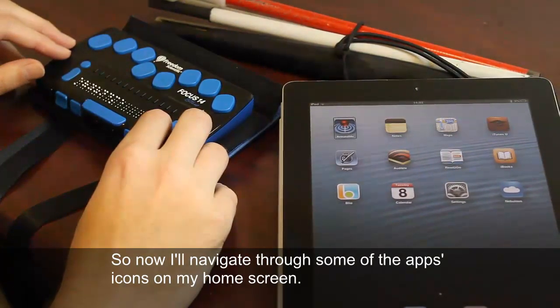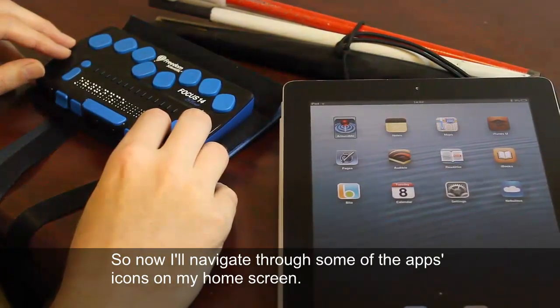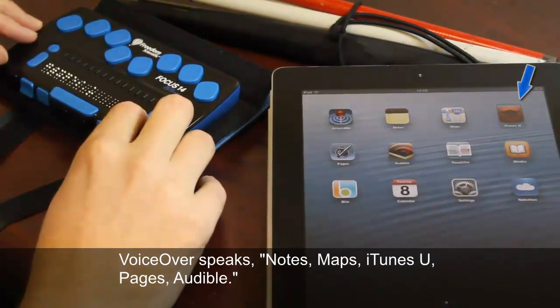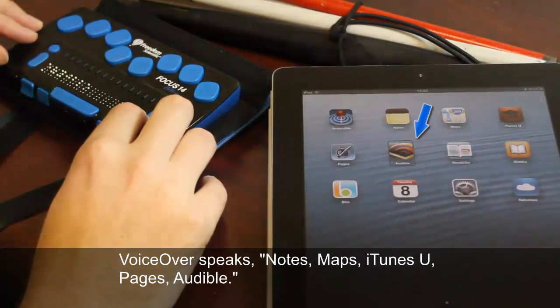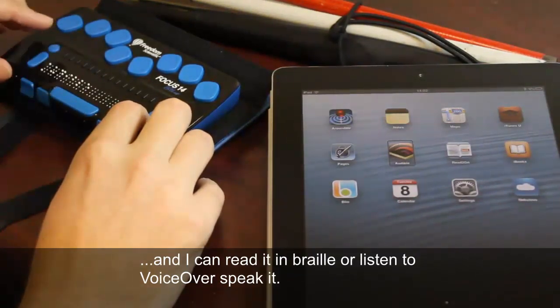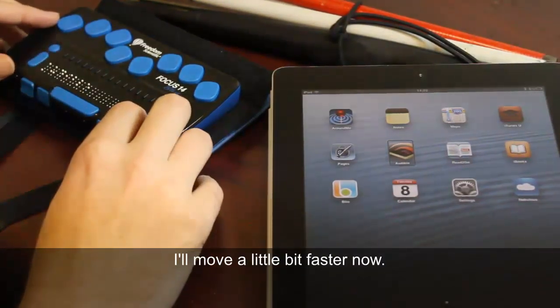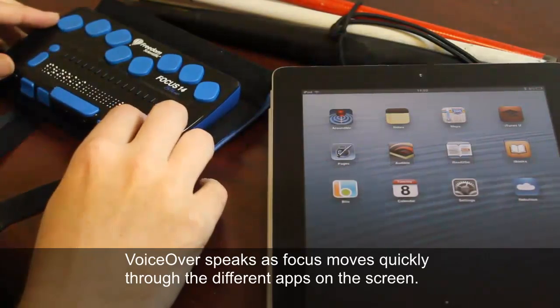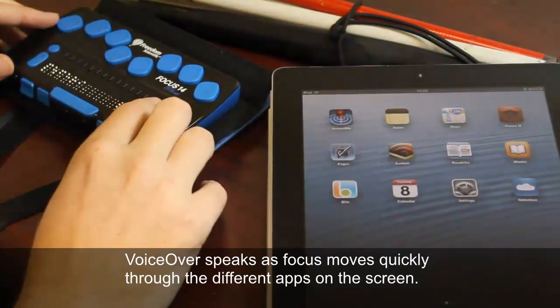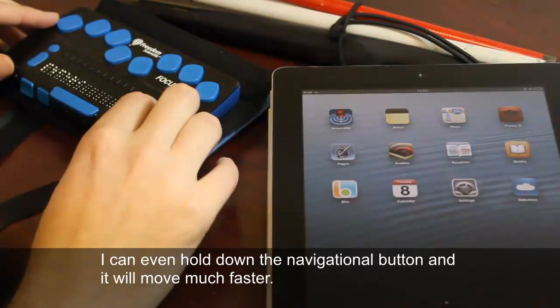Now I'll navigate through some of the app icons on my home screen — Notes, Maps, iTunes U, Pages, Audible. As I press the navigation rocker, the cursor moves from one app to another and I can read it in Braille or listen to VoiceOver speak it. I can even hold down the navigational button and it will move much faster.